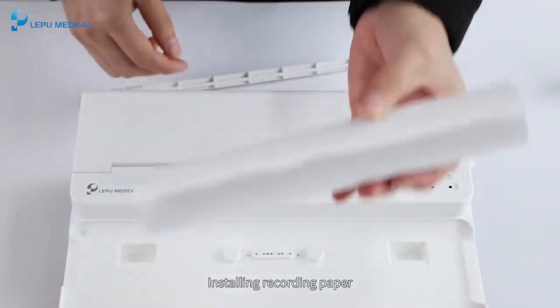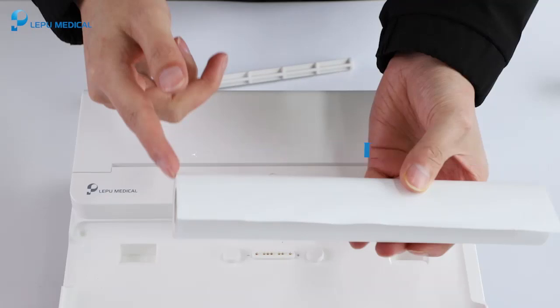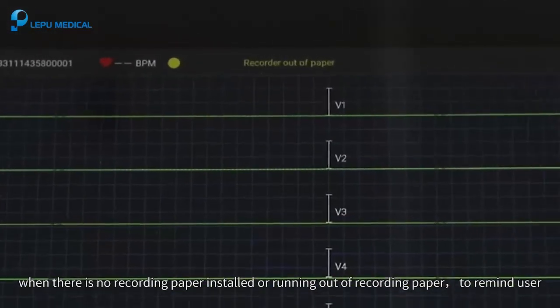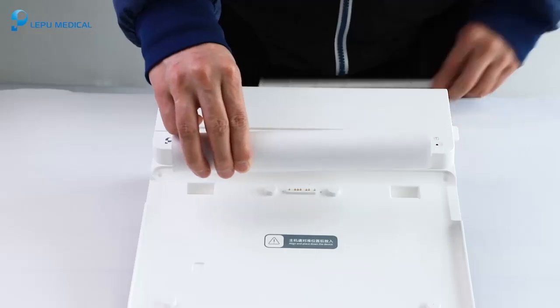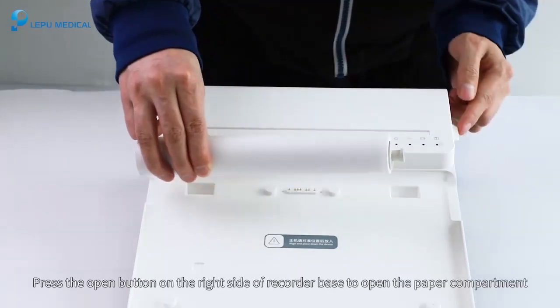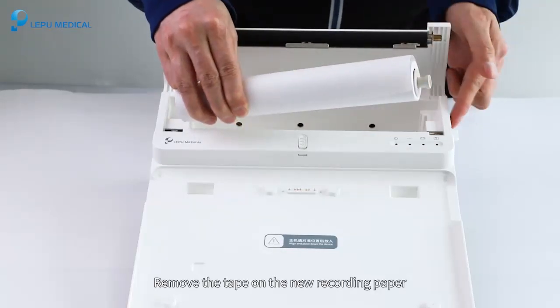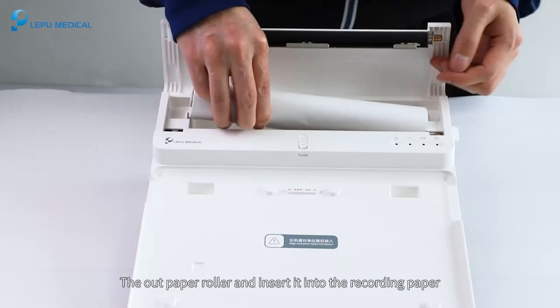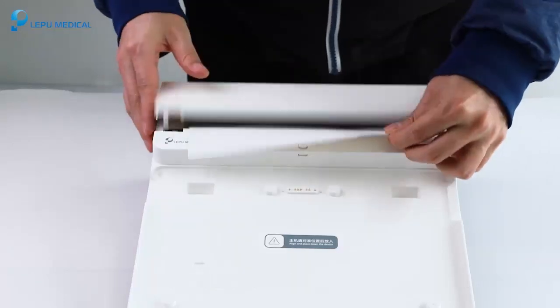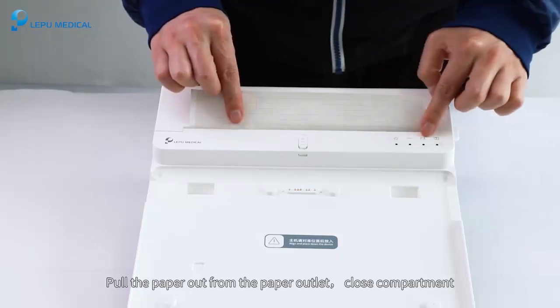Installing recording paper: the recorder base supports a width of 216mm rolling thermal paper. The device screen will display 'out of paper' when there is no recording paper installed or it is running out, to remind the user. Press the open button on the right side of the recorder base to open the paper compartment. Remove the tape on the new recording paper, insert the paper roller, place the movable end near the open button, and make sure the grid side of paper faces up. Pull the paper out from the paper outlet and close the compartment.